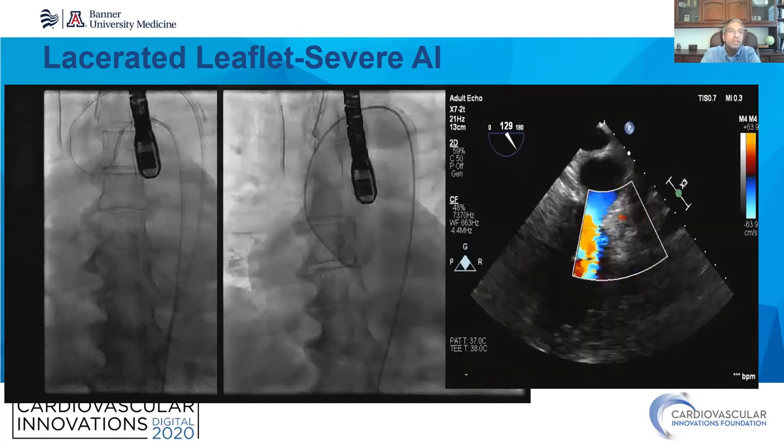We then are gently pulling both catheters with tension, and at the same time advancing dextrose through the side ports of the catheter to make sure that the electrical isolation is maintained and the energy is transmitted to the tip of the wire at the desired location.